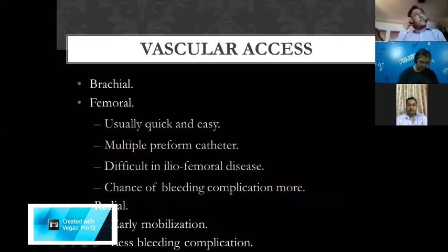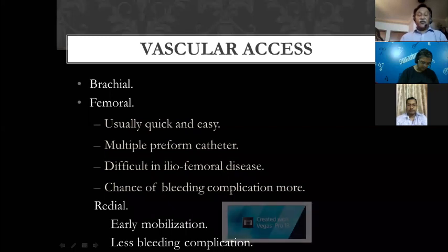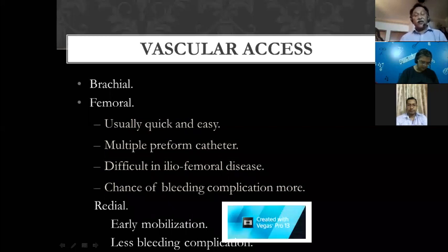And common access, although nowadays the radial is the major. It was done by brachial, then it. But difficult in iliofemoral diseases, and the complication is much higher. Contrary to that, the radial recently, most of the interventionists, most of the cardiologists now switch to radial because it is early mobilization, less complication, and patient comfort.